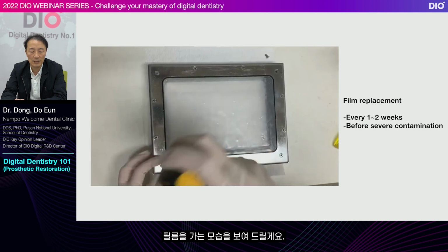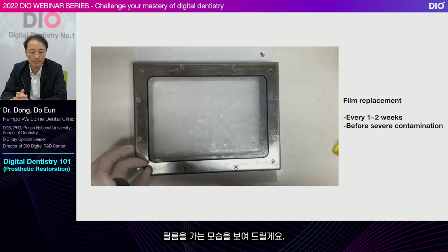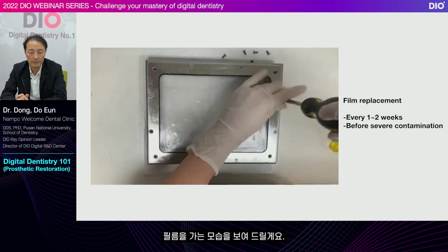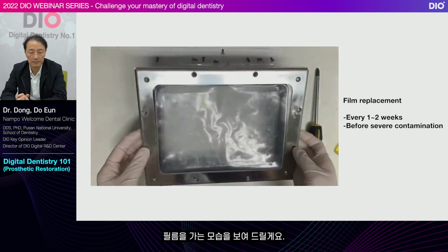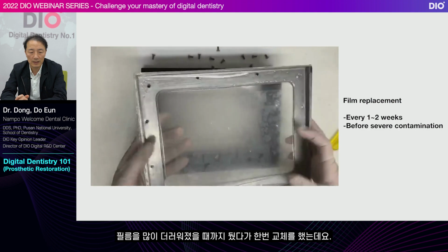I'll show you how a film gets replaced. I let the film get very dirty before replacing it.